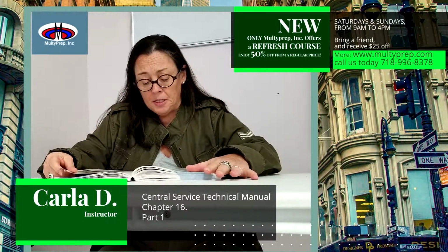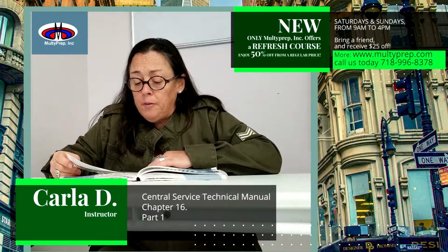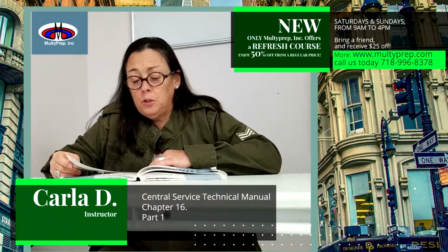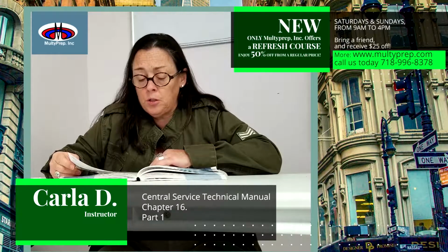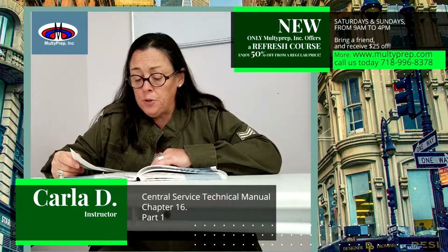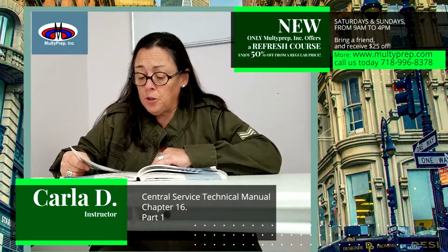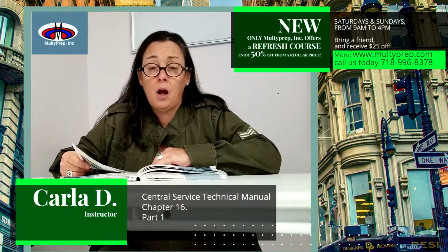Shelving must be designed to easily hold the total weight of the trays to be stored. Shelving should also be ergonomically friendly for central service technicians. Shelving should allow for easy access to the stored product. Shelving must be easily cleaned. Metal or plastic shelving is recommended for this reason. Porous materials such as wood should not be used as it cannot be properly cleaned and can harbor microorganisms. Closed shelving.